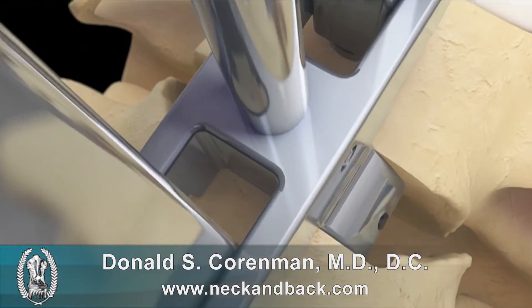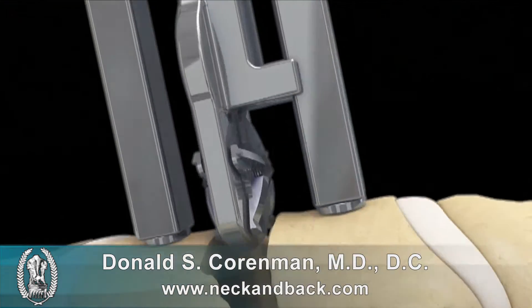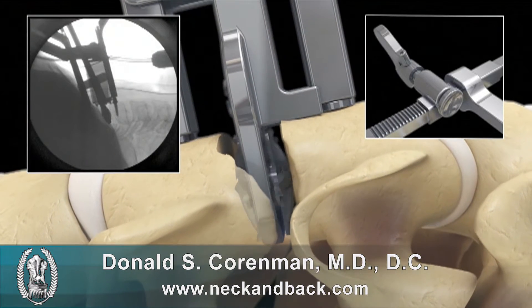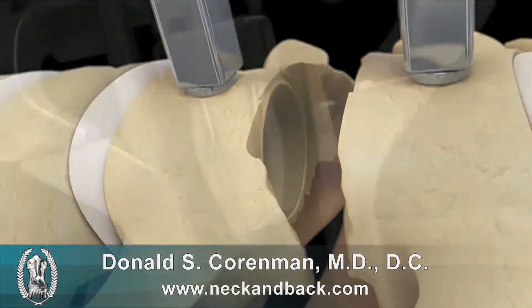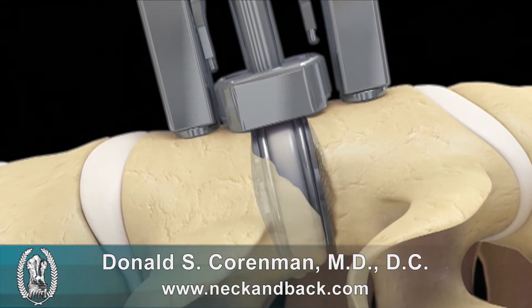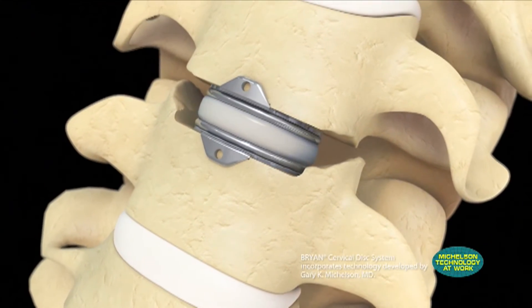Once you have this, this trial device should fit in and fit nicely adjacent to the disc space surfaces. This is an ingenious router that is placed in to create saucer-shaped depressions to fit the disc itself. You'll see here the saucer-shaped depressions. And then this is the actual artificial disc which is deployed. The deployment device is removed and now it fits in perfectly. There will be some ingrowth between the vertebra and this device.